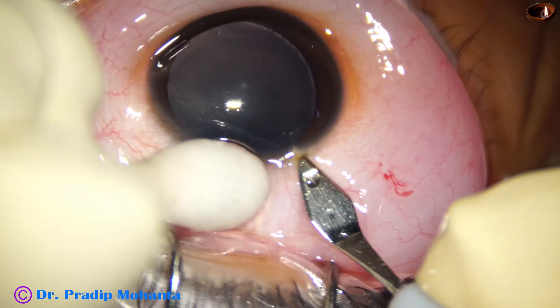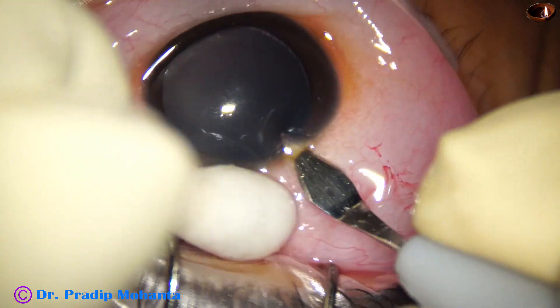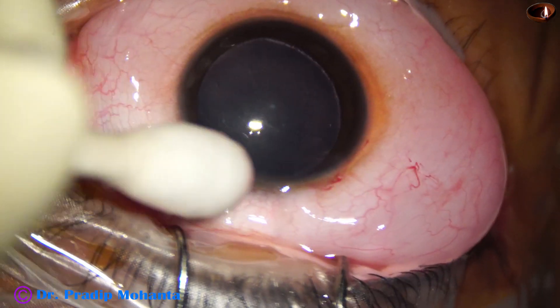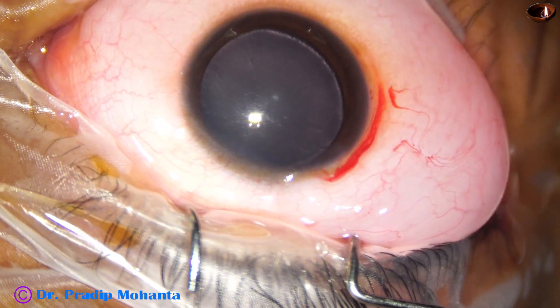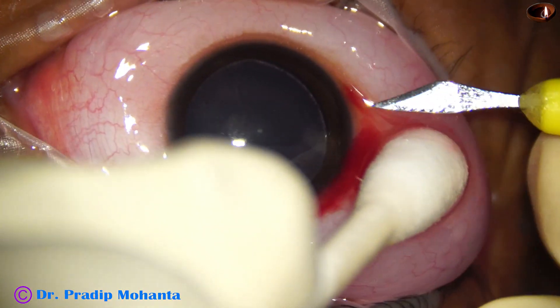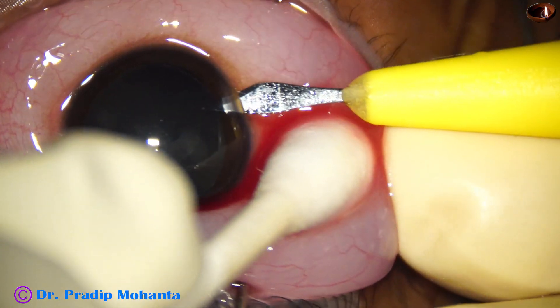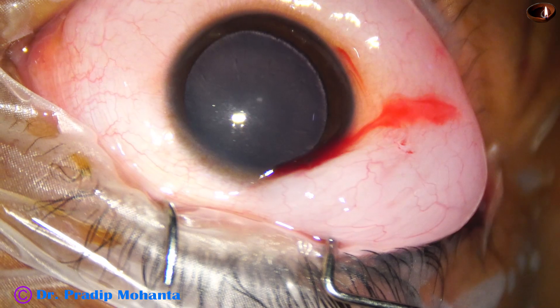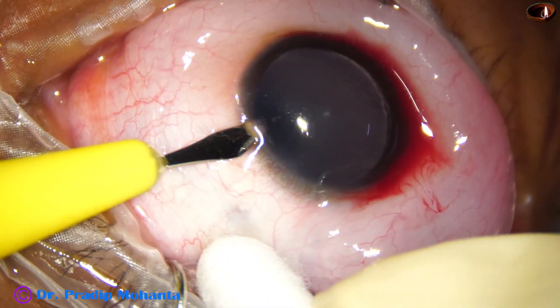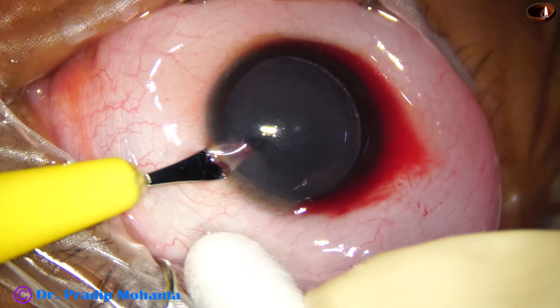The main incision is made just behind the limbus, that is on the sclera. Now two side ports are made in this case — one side port at 8 o'clock, and another side port at 2 o'clock.